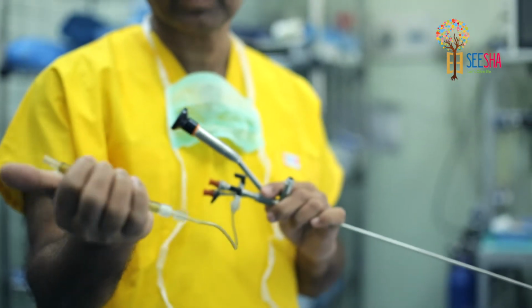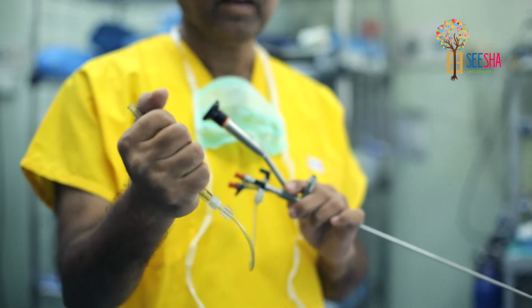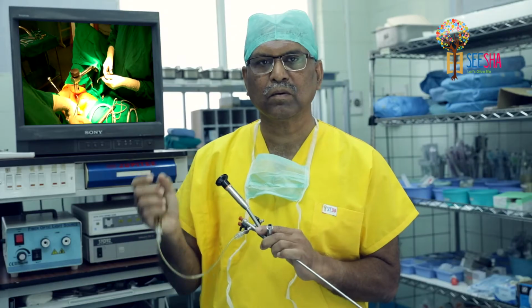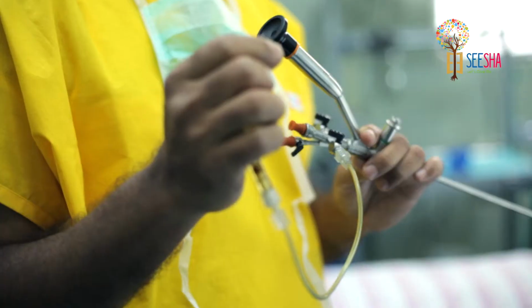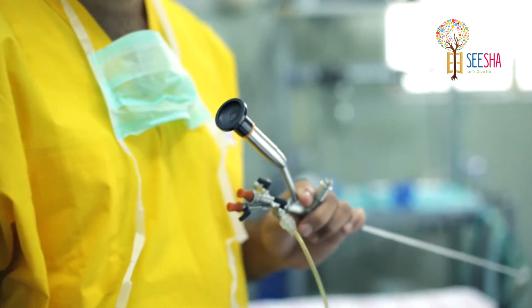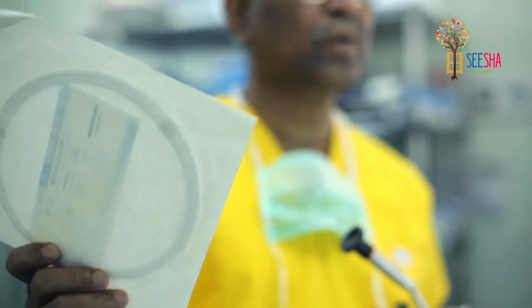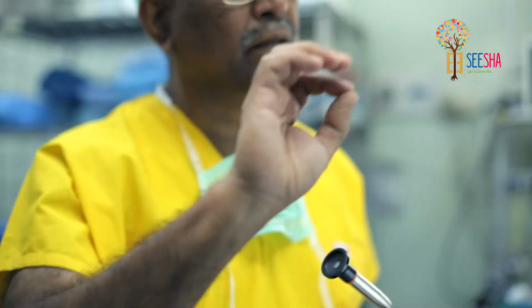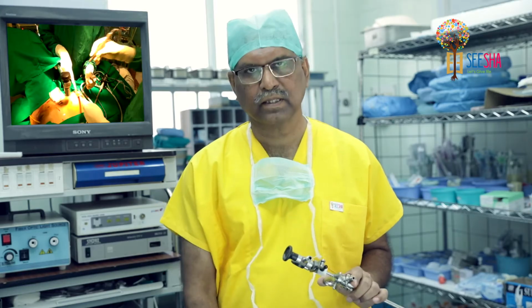And what we can do is, with methylene blue, we can use the pathfinder to flush any adhesions or any blocks which are there in the fallopian tube. This has been very successful. If that doesn't work, then what we do is we use a 0.025 inch guide wire and try and open out any of the blocks which are there in the fallopian tube. These are again instruments which are normally available with any urologist.